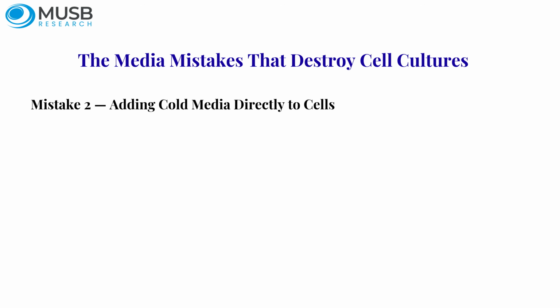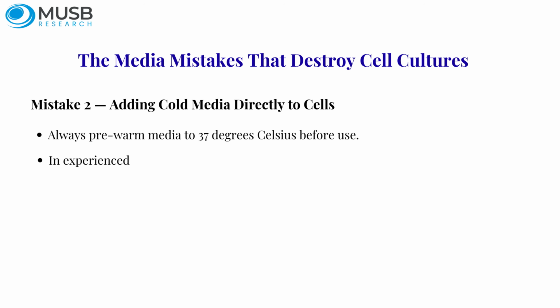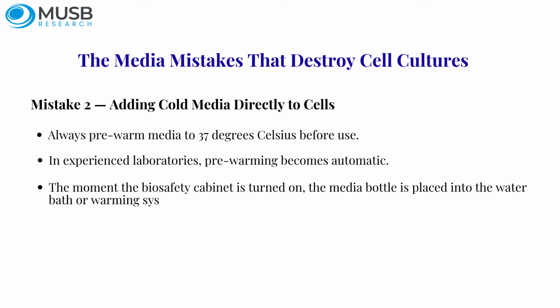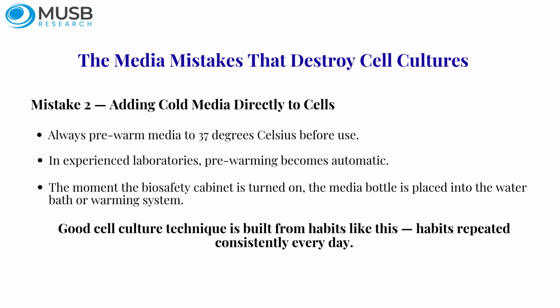The fix is simple but essential. Always pre-warm media to 37 degrees Celsius before use. In experienced laboratories, pre-warming becomes automatic. The moment the biosafety cabinet is turned on, the media bottle is placed into the water bath or warming system. Good cell culture technique is built from habits like this, habits repeated consistently every day.